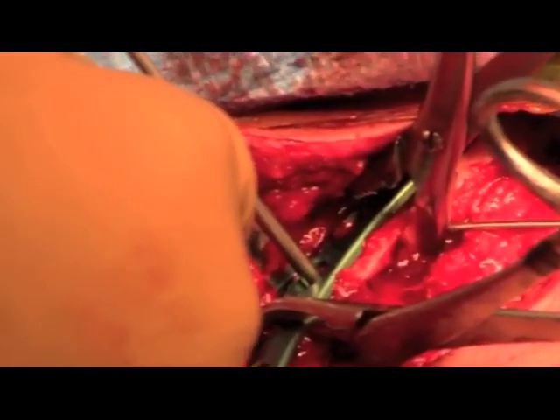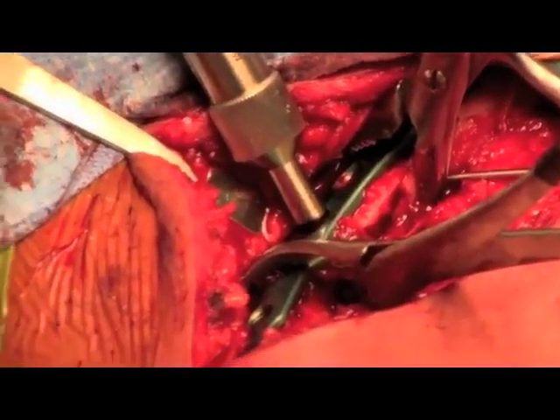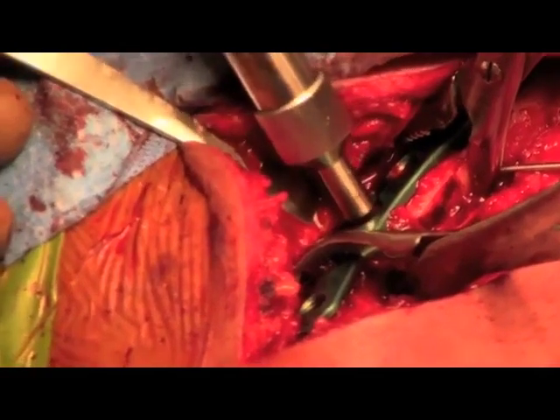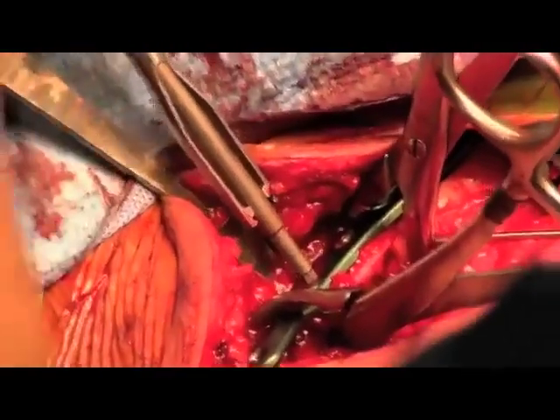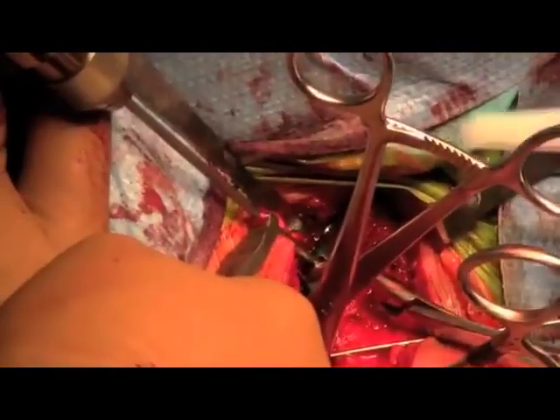If a simple fracture pattern is present, one screw may be placed on one side of the fracture and dynamic compression applied through the plate with a screw on the other side of the fracture. If the fracture is comminuted, as in this case, a bridge plating construct may be applied.